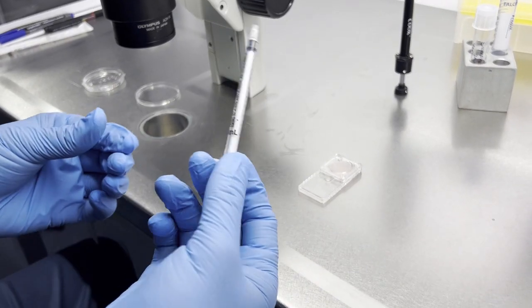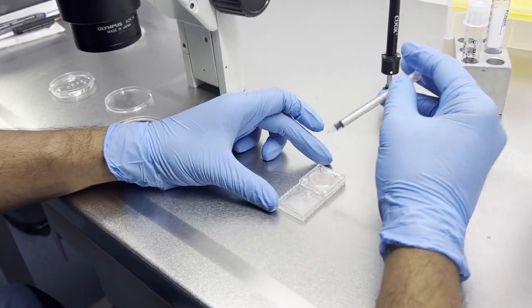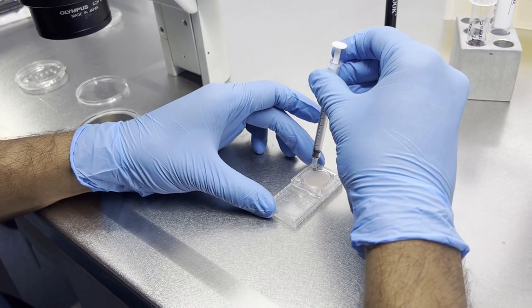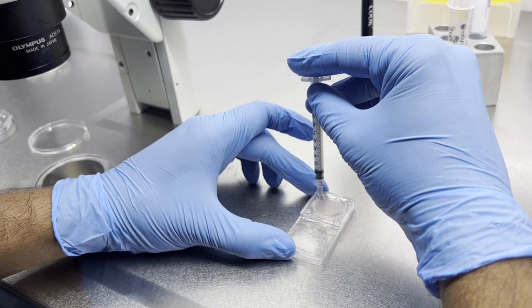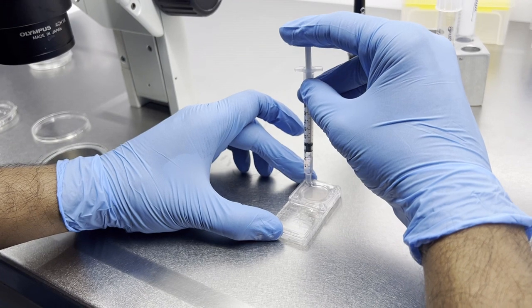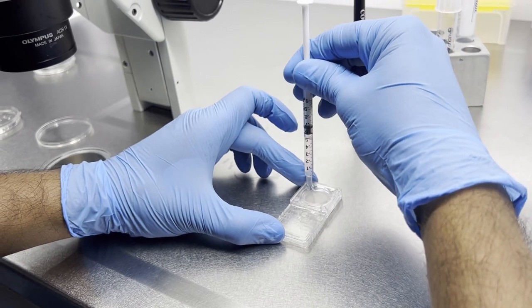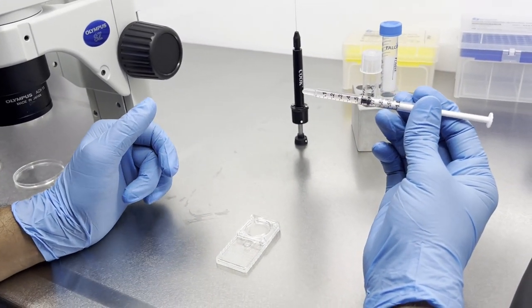You have to take a new fresh syringe. This is the first hole and this is the second hole. By putting this syringe into the second hole, we take the prepared sperm like this — up to 0.5 ml. We are going to use this sample for our ICSI procedure.